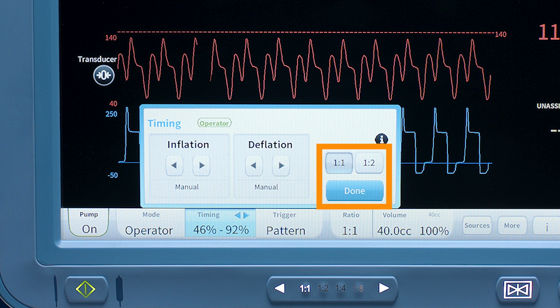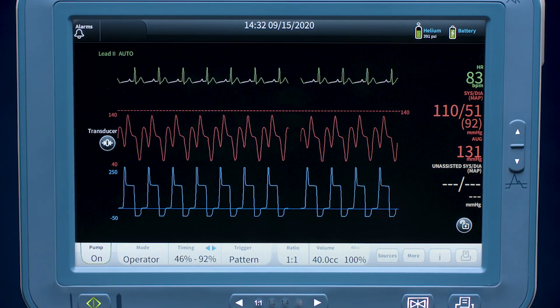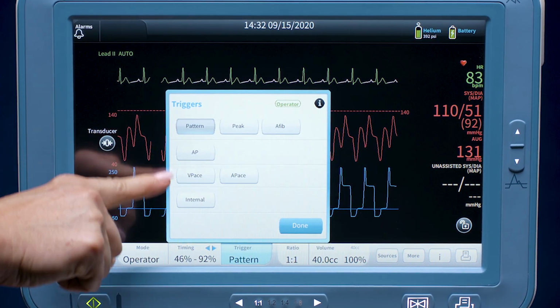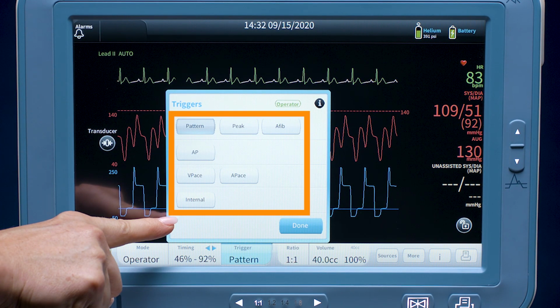Since timing assessment should be done in a 1:2, the assist ratio selections for 1:1 and 1:2 are also displayed in this menu. The user can also select and change trigger modes while pumping. In most cases, more than one trigger mode will work with a cardiac rhythm. The user should assess both the trigger reliability and timing accuracy to determine which is the best trigger to use.